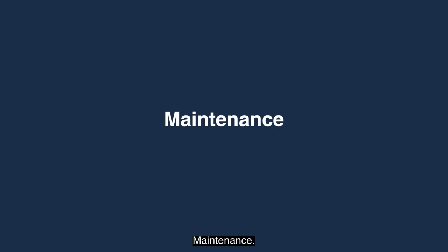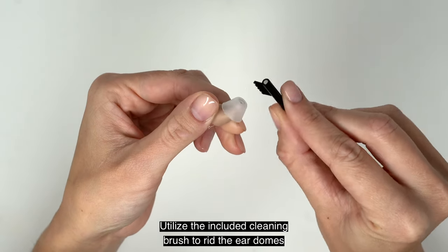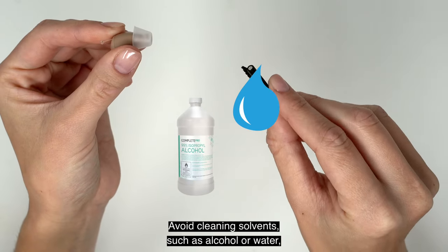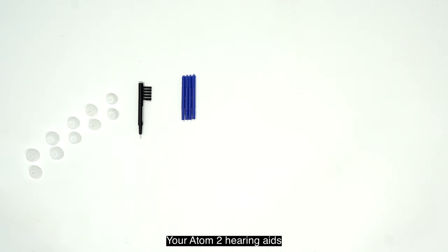Regular cleaning is key for maintaining your Audion Atom 2's performance. Utilize the included cleaning brush to rid the ear domes and the device of wax, dirt, or debris. Avoid cleaning solvents such as alcohol or water, which may damage the device.